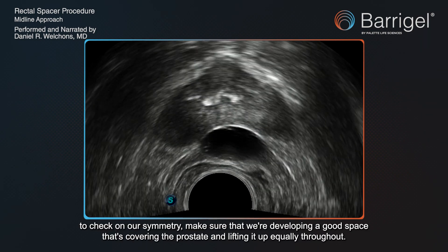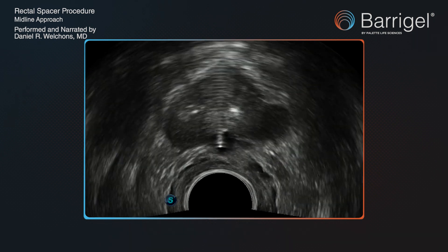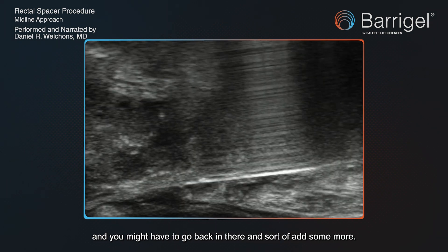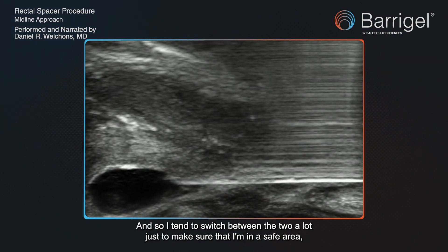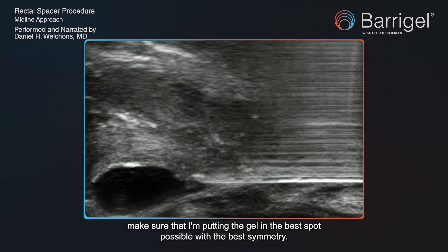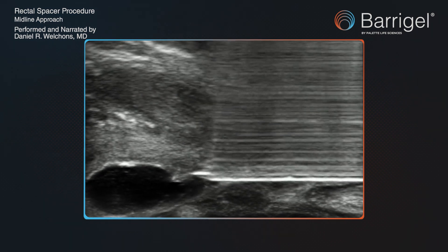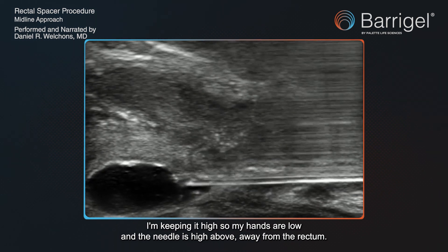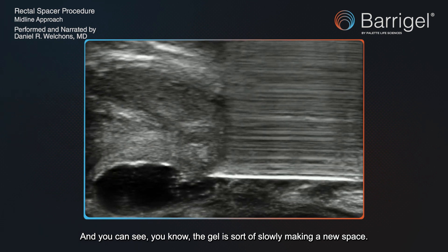We go back to the axial view here to check on our symmetry — make sure we're developing a good space that's covering the prostate and lifting it up equally throughout. Then you find your needle tip and identify where you might have a paucity of gel and may need to go back in and add more. I tend to switch between the two views a lot just to make sure I'm in a safe area, putting the gel in the best spot with the best symmetry. Here I'm probably feeling around to make sure there's not too much resistance, pulling back a little on the needle, keeping it high — hands low, needle high, away from the rectum — and injecting slowly.